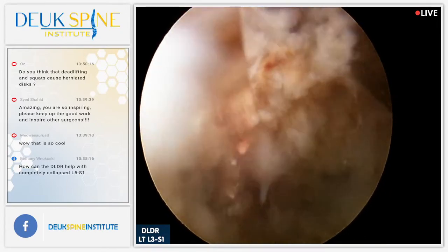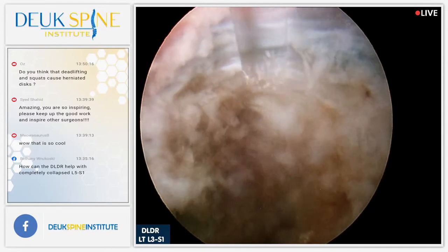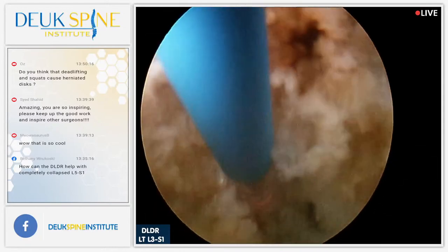We have a question. Give me a second. You guys see the fibers right there that are running left and right? Those are really up and down. That's the posterior longitudinal ligament right behind the disc.